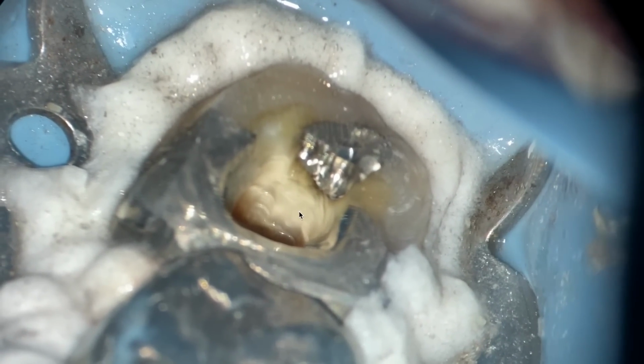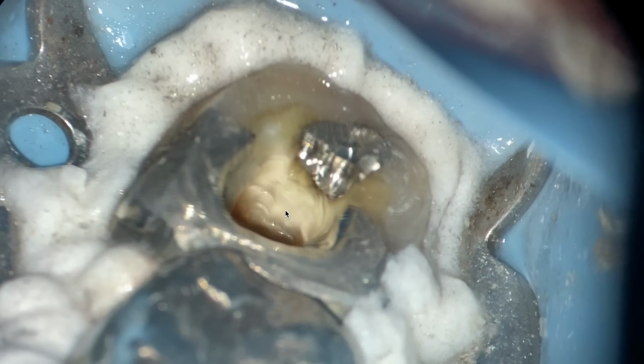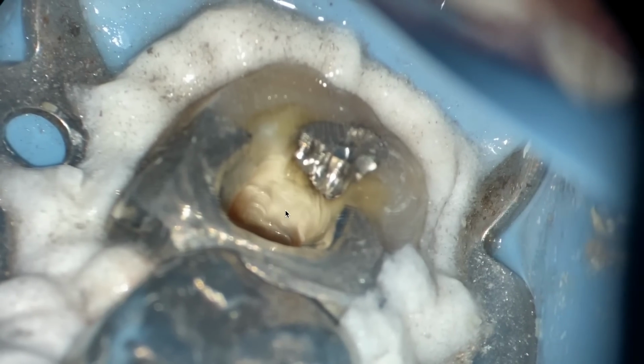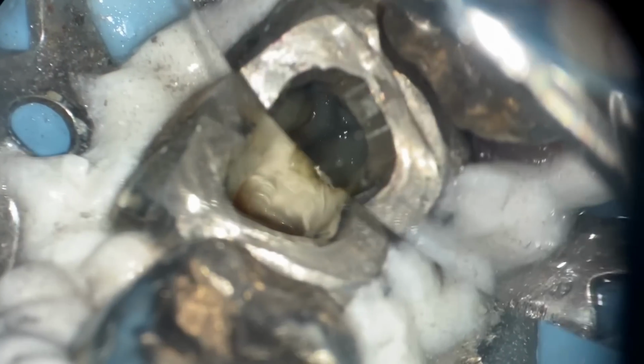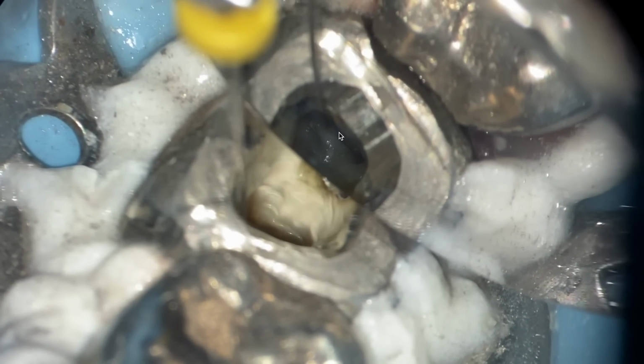So that's another tip I'm going to be doing here. You see how my dental assistants suction all of the irrigant out of the pulp chamber? The reason is there are 2 stages we're going to be doing here. There's one, cleaning and shaping, and the other is just getting a working length and glide path. When I'm trying to get a working length, my canal with the pulp chamber is dry.